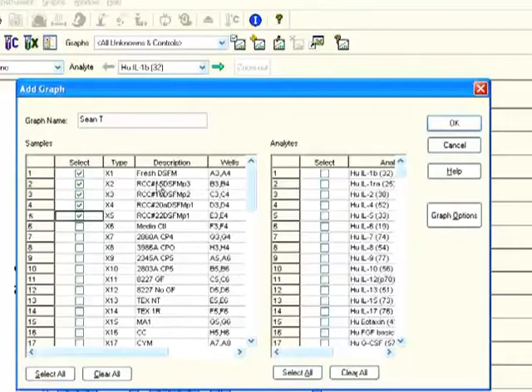You'll notice that this plate here had all different analyses, all different types of samples run on this. This was actually a multi-lab demo that we did. So we invited multiple labs to analyze 6 or 7 or 8 samples with this 27-plex assay. So this was, for example, one set of experiments, and then here was another lab that submitted, and down here was another one, and so on and so forth. So let's say I want to look at these samples here from a particular lab, and I want to look at all the analytes.